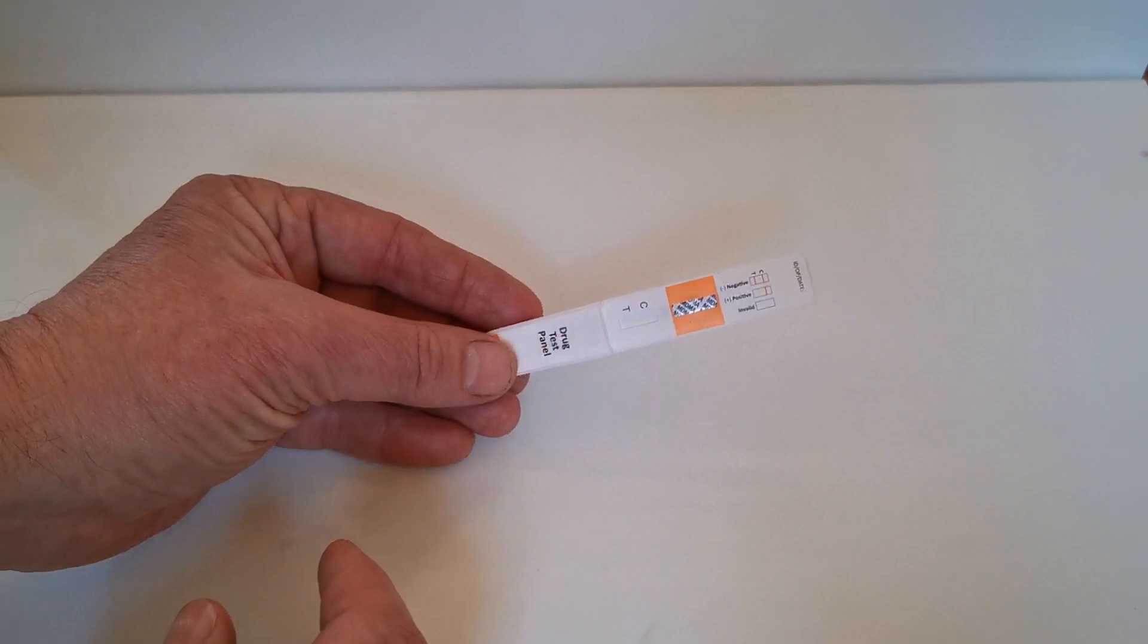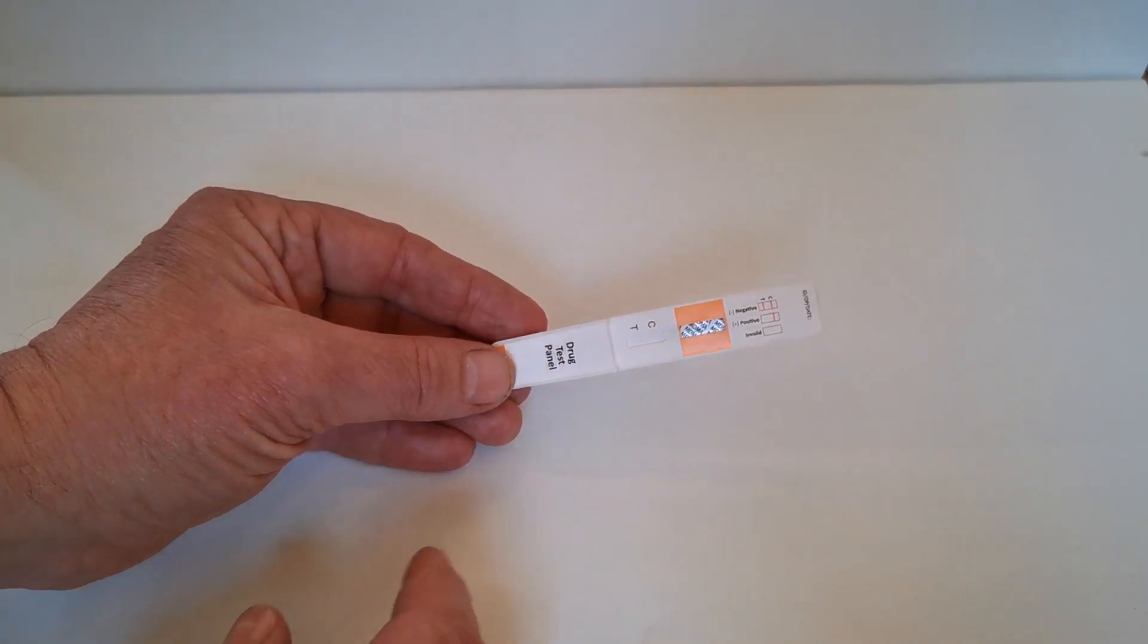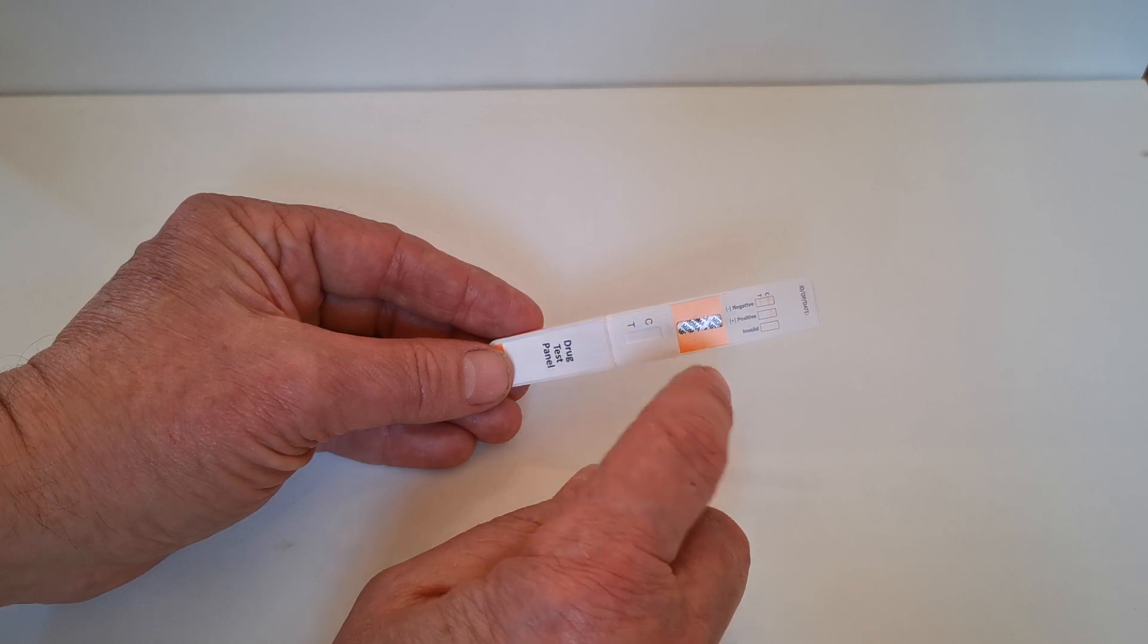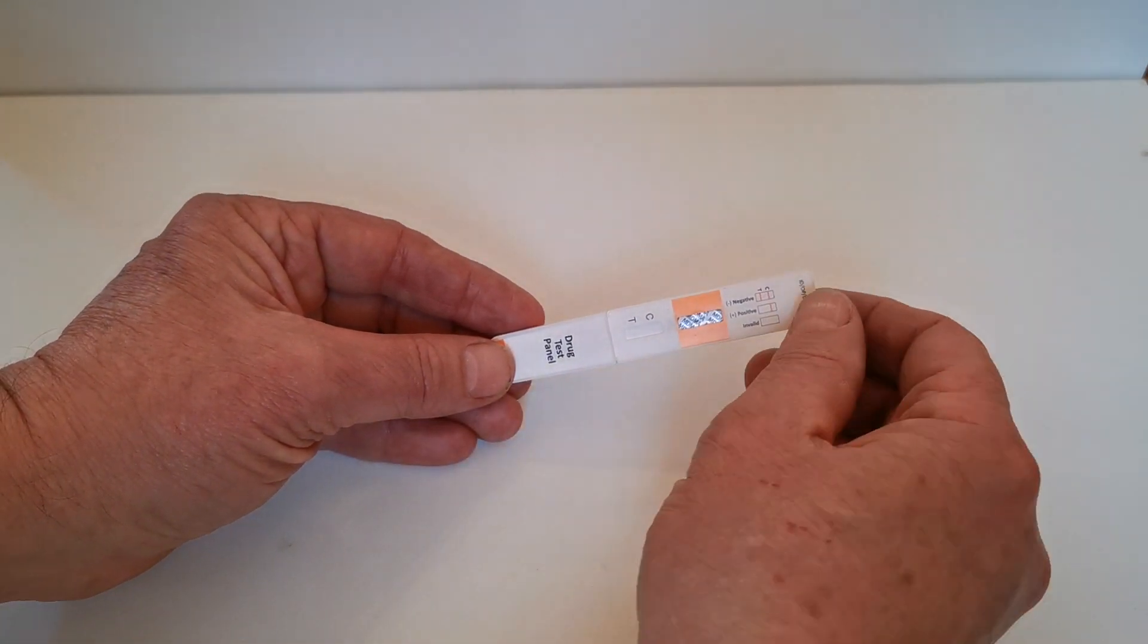Inside the foil you'll be presented with one of these test cassettes with a prong. It has the MDMA coding in the window here showing that this screen is for ecstasy MDMA.